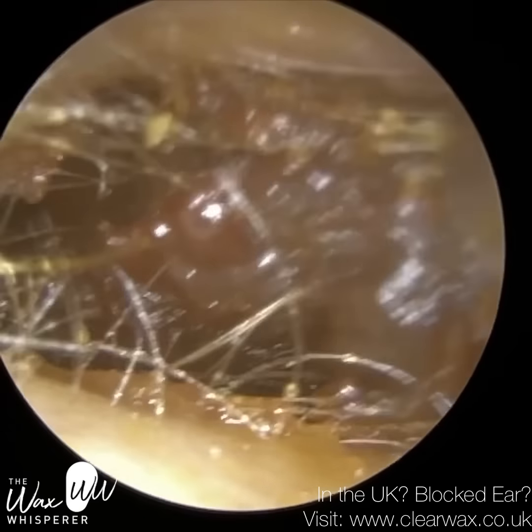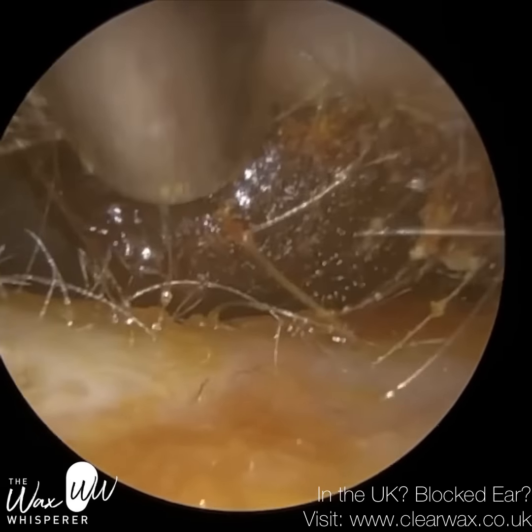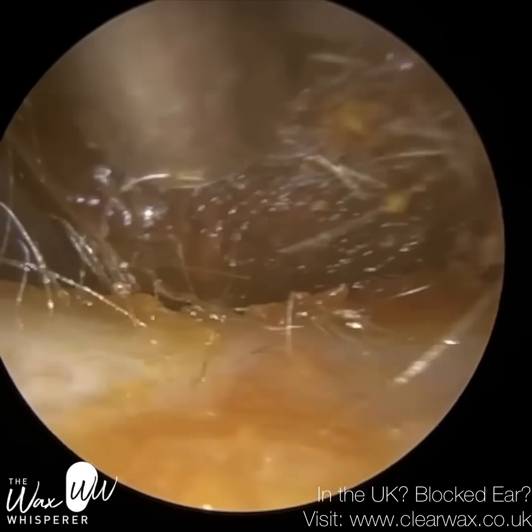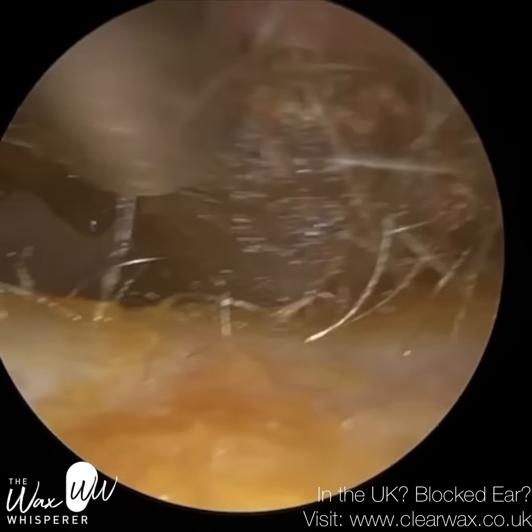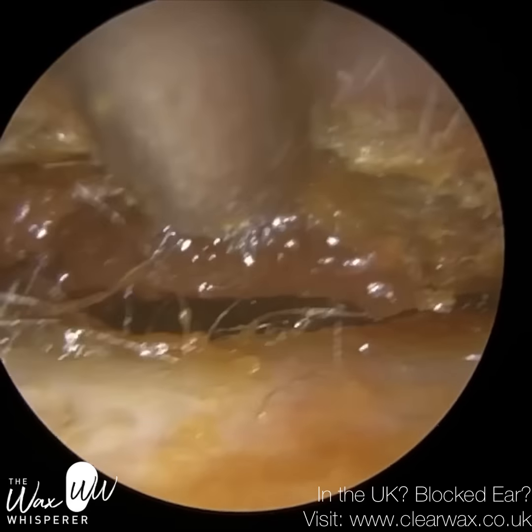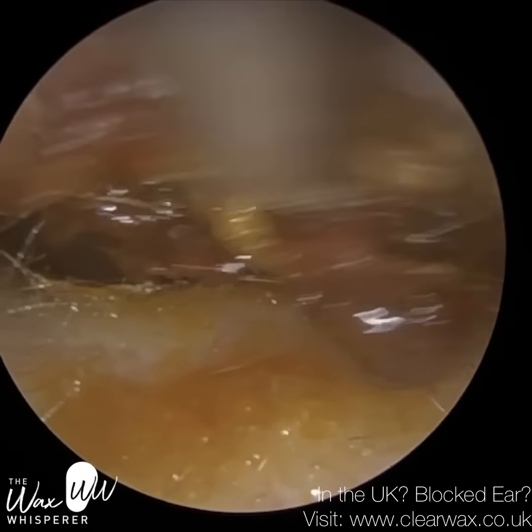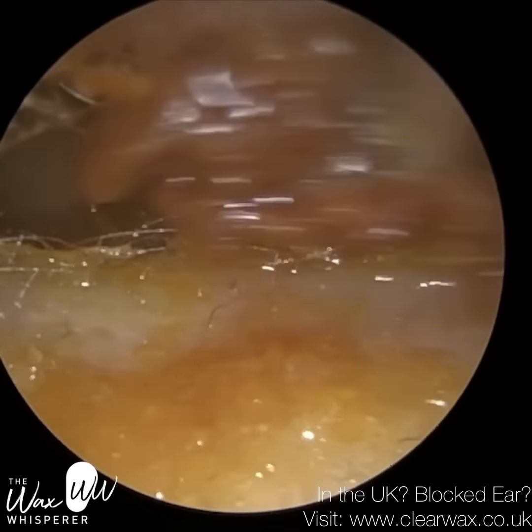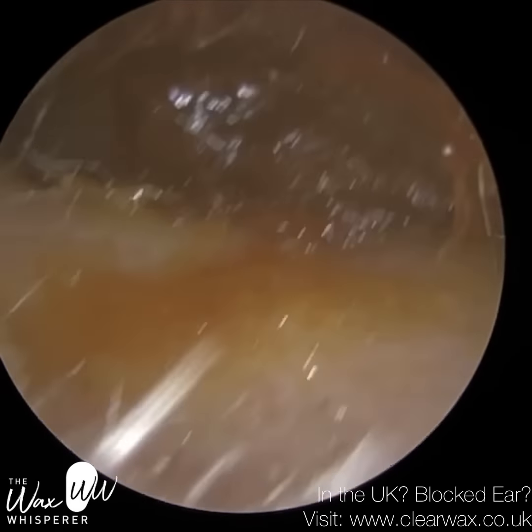So we're almost trying to defy physics here by doing this. Fortunately, the wax is soft. The cartilage is also malleable, so it does stretch slightly. So I'm just trying to roll this down and wriggle it and jiggle it through. And the wax plug is soft, but it's also firm enough to expand the ear canal, the cartilaginous portion, as we're bringing it through. This part got separated, I think, from the main blockage.